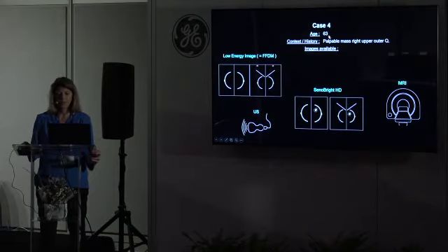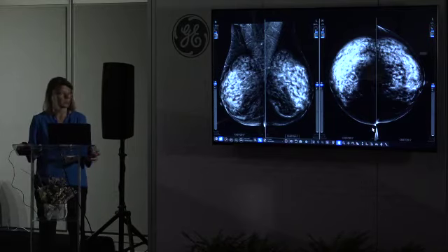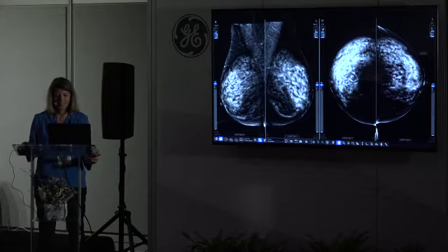Another case, a 63-year-old woman with a palpable mass on the right breast. In this case, we have an MRI, and I will show you the corresponding MRI. Again, even though she's 63, she also has very dense breast. So do you see something here? Maybe more difficult. Right, you see? Maybe here. Yes, it looks like it. But maybe it's density, so not so easy.